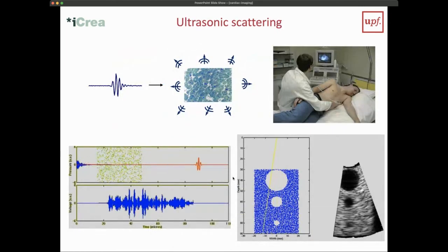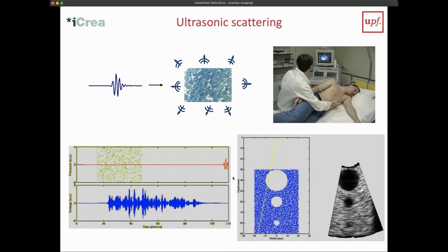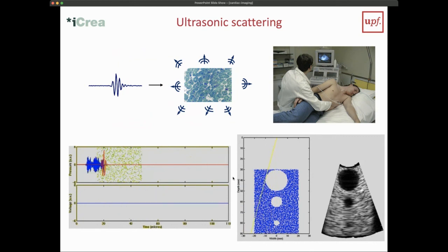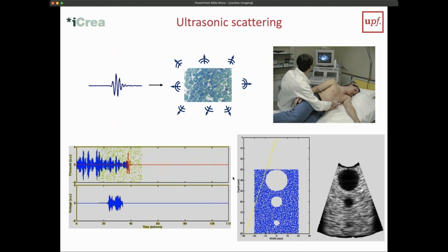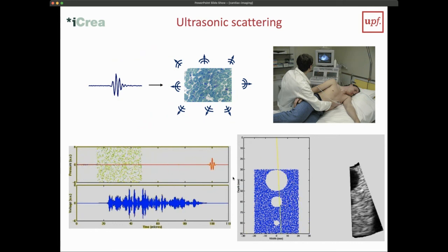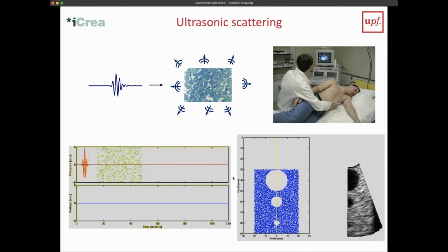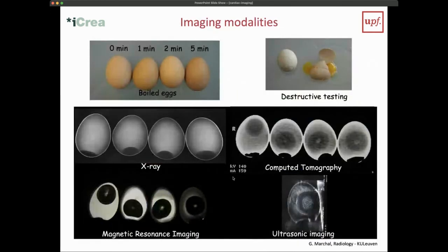And then lastly, we can also use ultrasound imaging. The idea here is that we transmit ultrasound waves into the body, and we look at how these are reflected by different structures. So we look at acoustic properties and acoustic reflection, specifically of boundaries of large organs, as well as within tissue, looking at scattering. So this is what we have in our proposal.